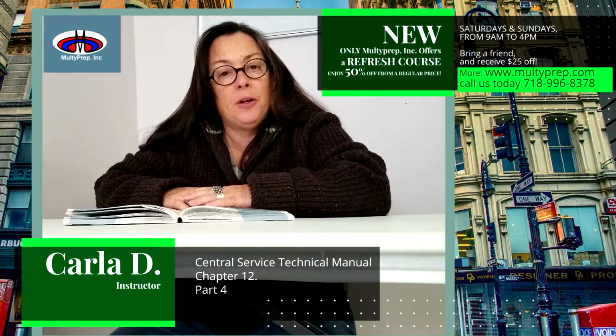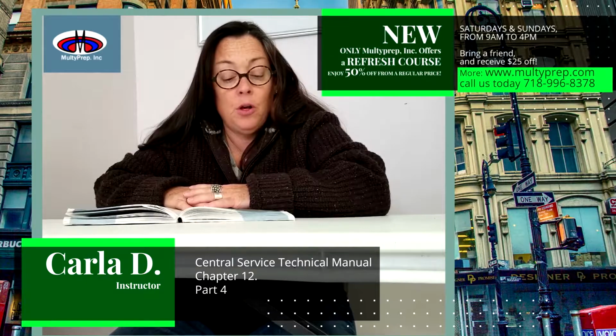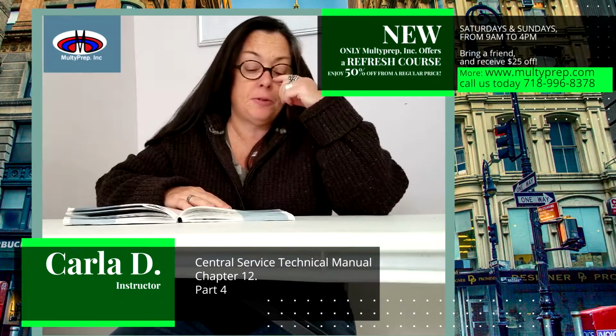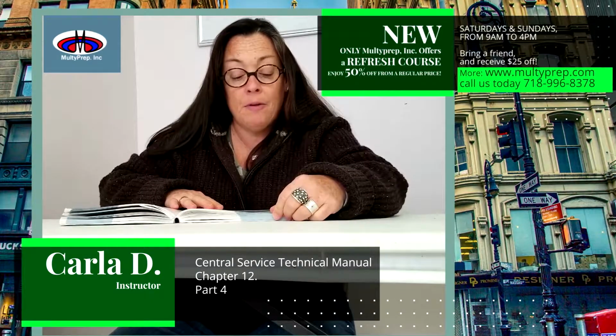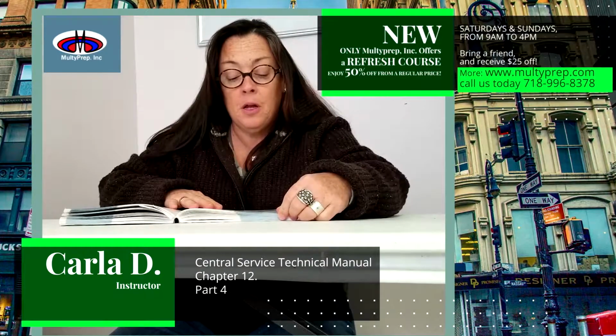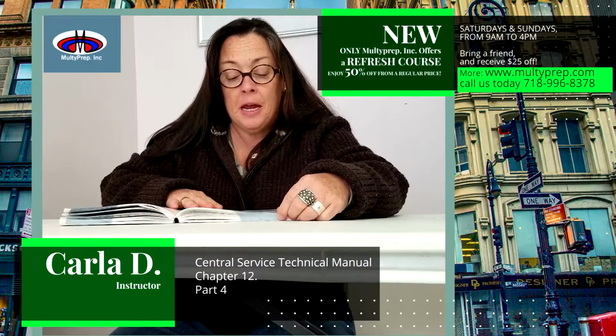Reusable packaging materials. There are two basic types of reusable packaging material: woven fabric and rigid containers. Woven fabric materials. Before the early 1980s, woven textiles were the reusable packaging material of choice. However, new technologies have increased the choices for sterilization packaging. The standards for manufacturing today's packaging materials have been based on penetration and microbial barrier capability measurements for a minimum of 140 thread count, threads per square inch.